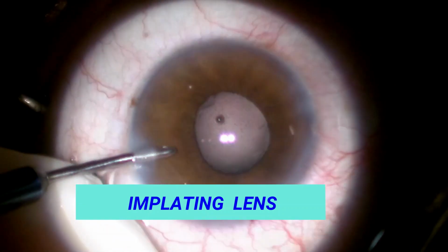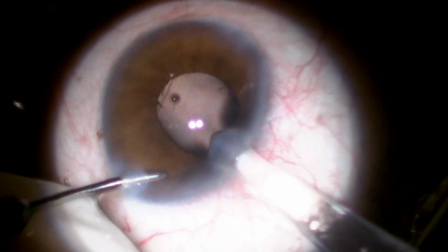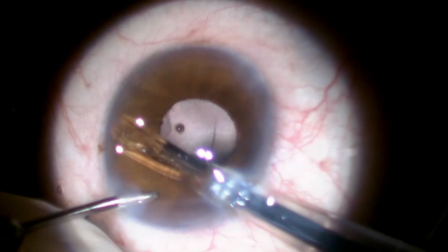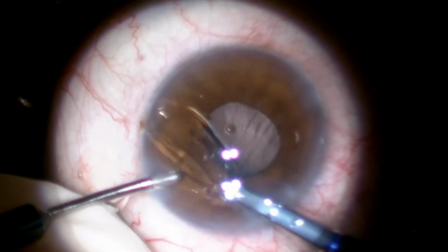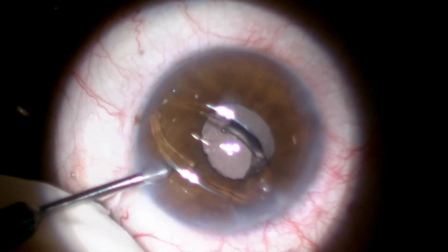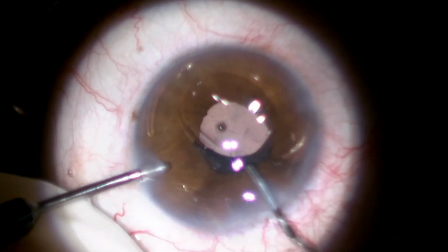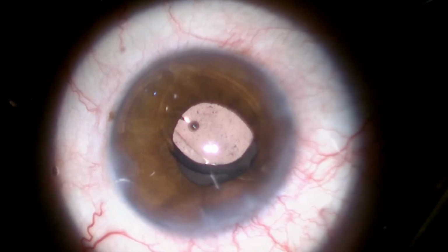now I am implanting the intraocular lens. First I am opening the lens over the iris, as there is no posterior capsular support. Once this lens is open in the anterior chamber, I will be placing the lens in the sulcus.